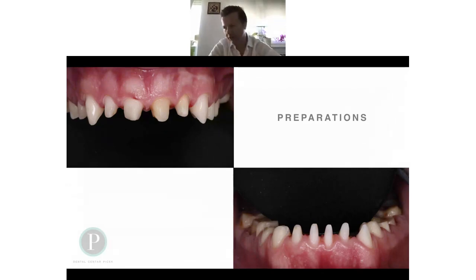If you are aware of one margin, which is on the junction between soft tissue and the border of the preparation, and if you do the window, you then have two margins, because you have to be aware that the margin on the incisal and on the cervical part will remain the same on the day when we put the veneer and later, that it won't change the color.